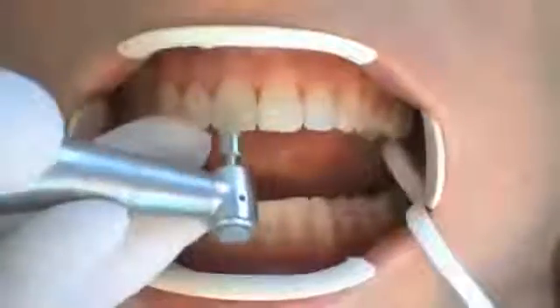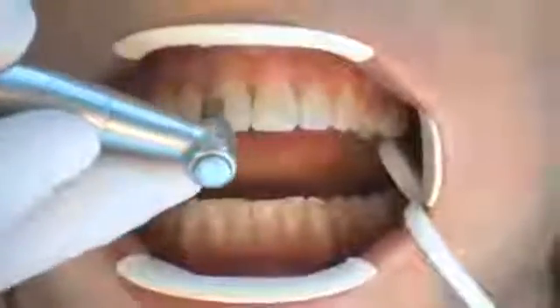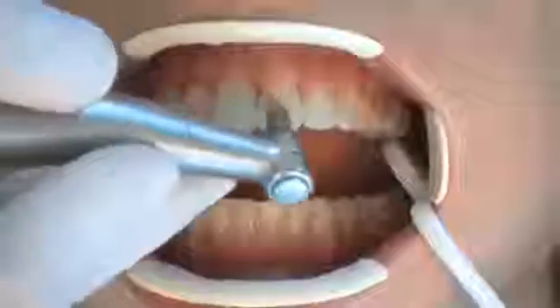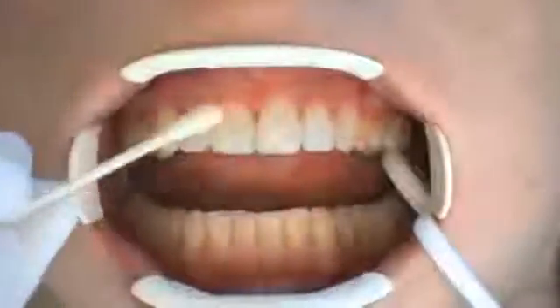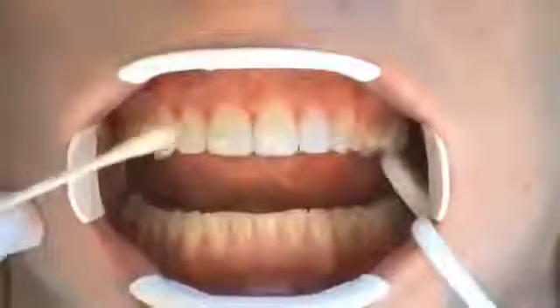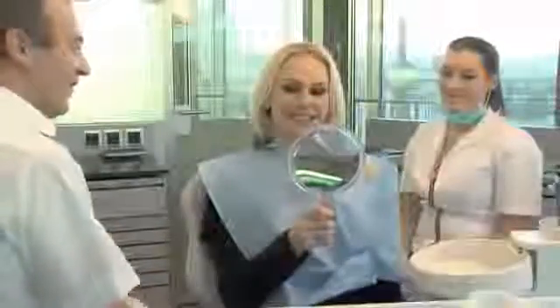Silicon carbide-coated high RPM brushes operating in a dry environment with air cooling are the best means of achieving an optimum high gloss. The application of fluoride prevents the deposition of colors in freshly treated areas of enamel. Patient and dentist jointly assess the appearance of the restoration at the end of the treatment, and a follow-up appointment is agreed where extensive restorations are being carried out.